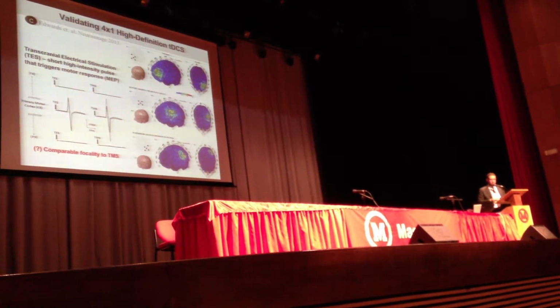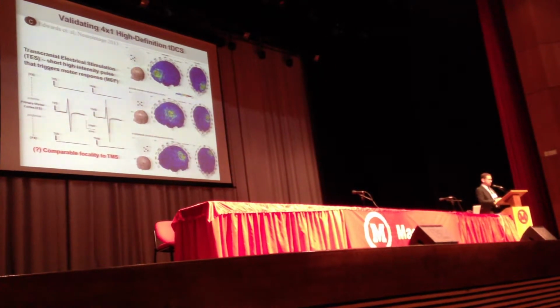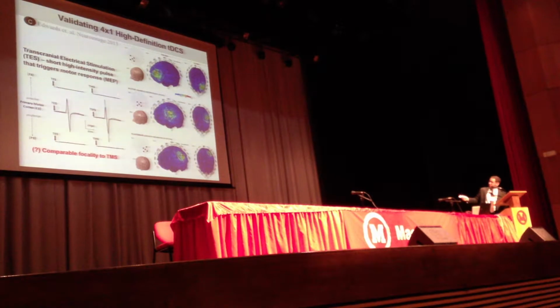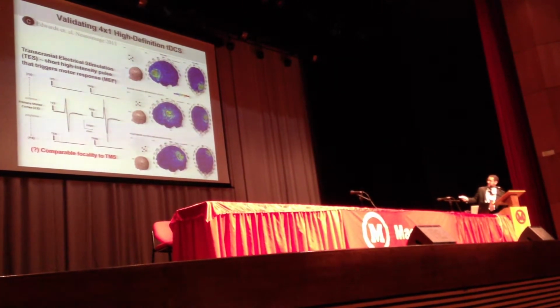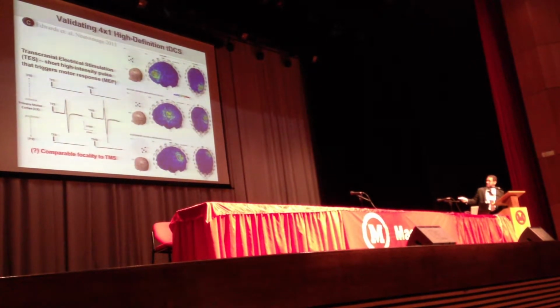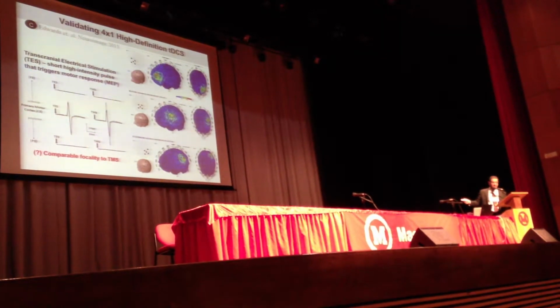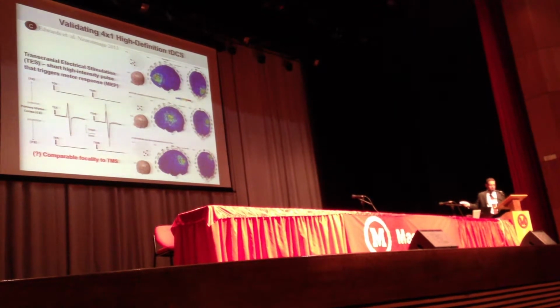What we did was, though, we used the 4x1 montage, and we applied high voltage shocks, so 1,000 volts. And we initially positioned the 4x1 montage over the motor region. And when we did this, we were able to elicit an MEP. So this is the 4x1 montage with 1,000 volts, and we're getting an MEP. Now we can take a conventional TMS coil, a figure-of-8 coil, put that over the same region, and confirm that that region is indeed the motor region, and we get another MEP.